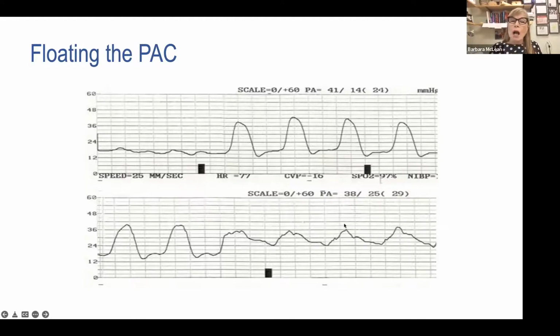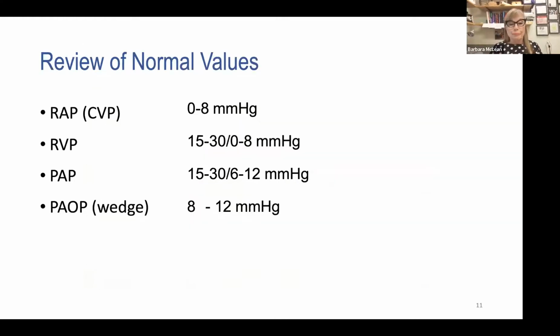Now, the systolic component of the pulmonary artery is very much like the systolic component of the right ventricle. What's really different is diastole, because our artery is much smaller as a chamber. The diastolic pressure is going to be higher. In the right ventricle, you're looking at a big right ventricular chamber, so diastolic pressure is low. And once you move into the artery, the diastolic pressure is higher.